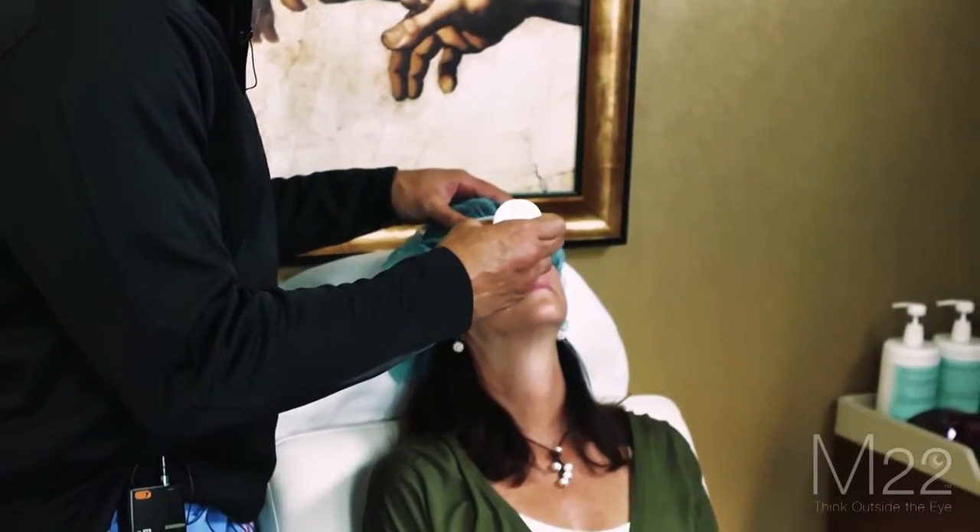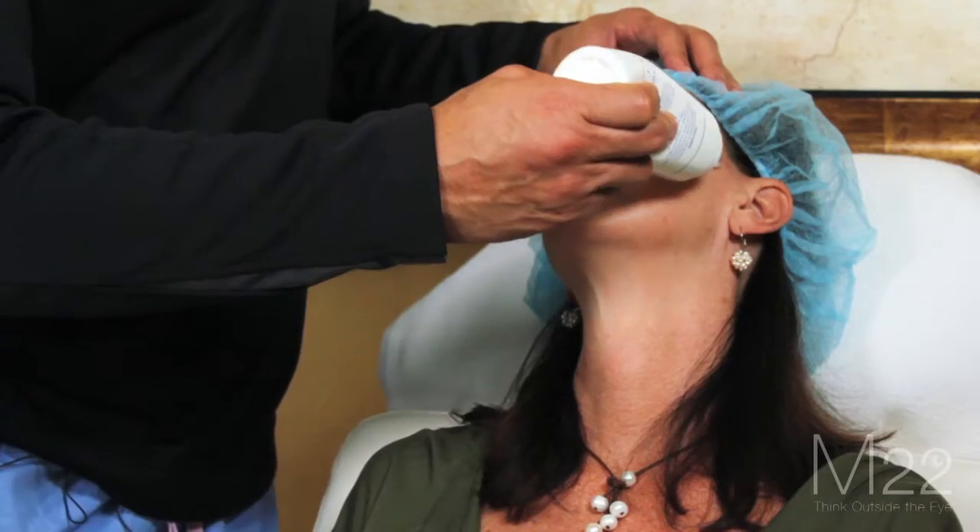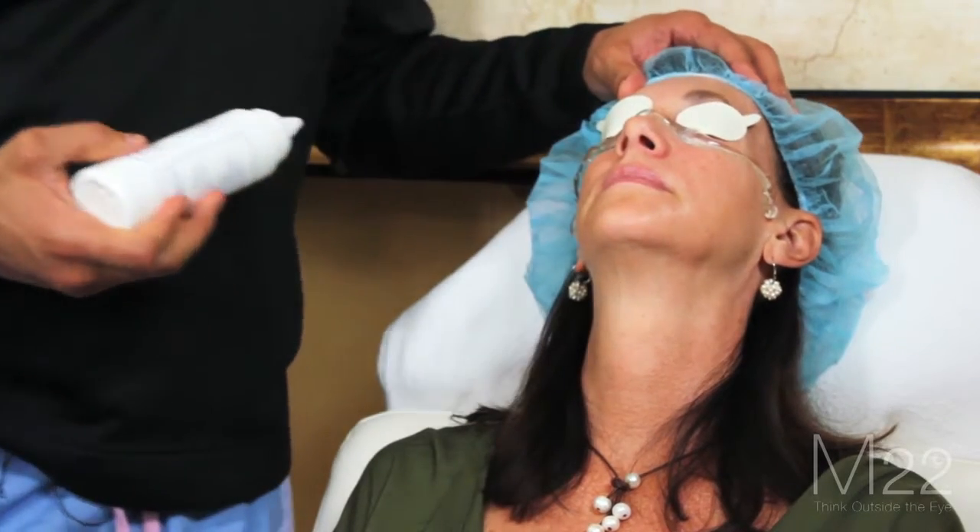Then we take some ultrasound gel — this is the same ultrasound gel that you would find for doing an ultrasound on a pregnant woman — and we're just going to apply a little thin sheet of ultrasound gel right in the area that we're going to be treating.